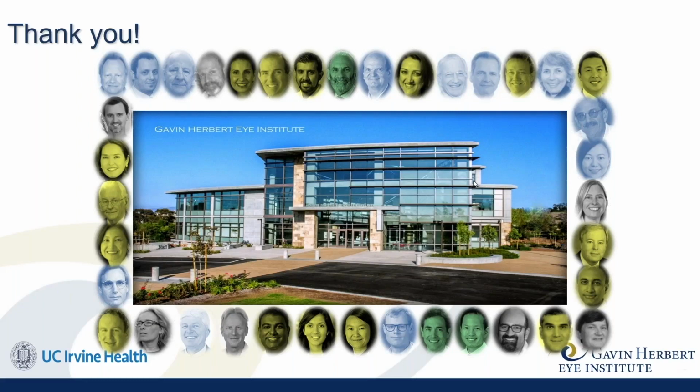He said that helps, but it's not the reason why I'm here. I have a problem with metamorphopsia between the two eyes. He has a normal foveal contour. I am getting a color vision test on him to see how significant it is.